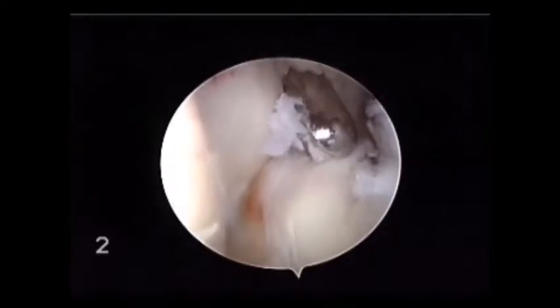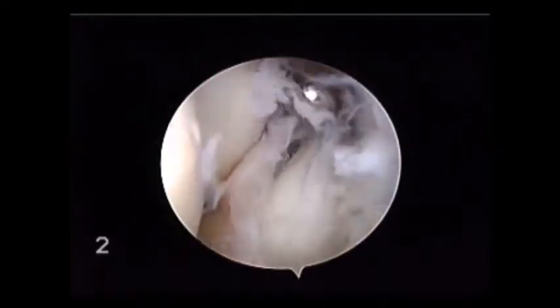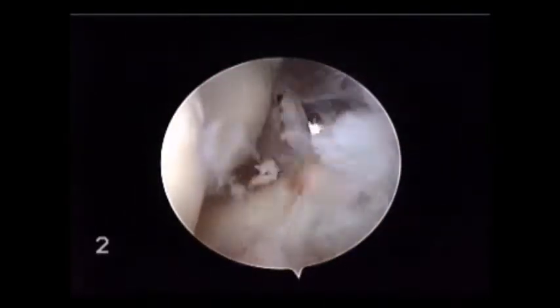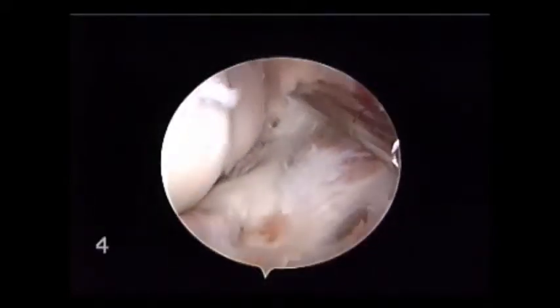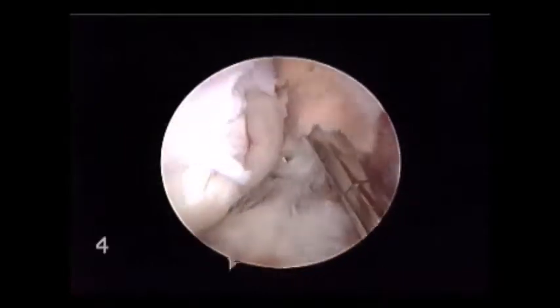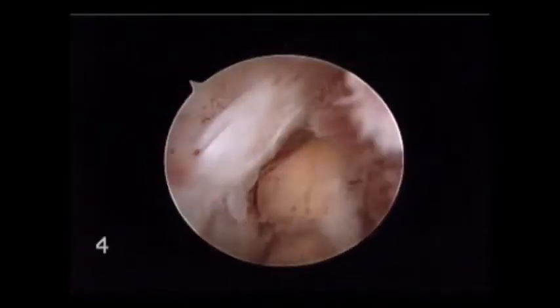We can see the entire anterior capsule, as viewed from laterally, has been excised. In the same patient, if we look from anterolaterally, we can see the radiocapitellar joint, we can see the debris anterolaterally, and we can see the leading edge of the released capsule, which basically falls into our field of view and is more easily excised, again protecting the all-important neurovascular structures anteriorly.